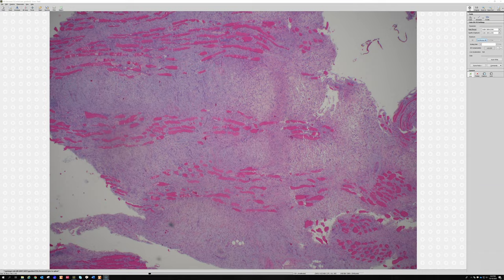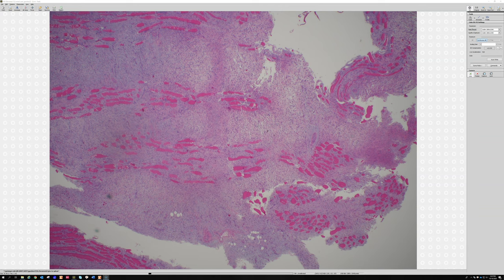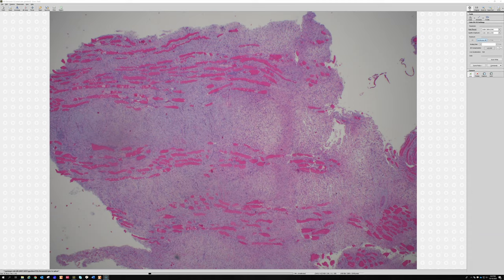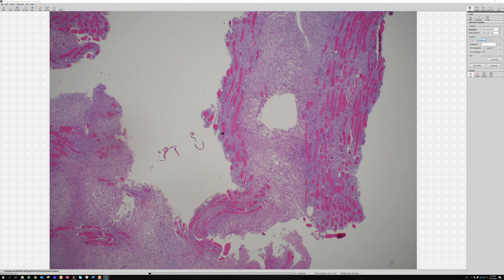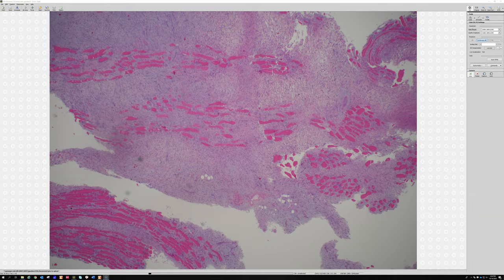Myxofibrosarcoma might infiltrate focally, but the fact that every single muscle fiber here is splayed apart perfectly is very characteristic of proliferative myositis. This case was actually one of the flat muscles of the forearm in an older patient, and the whole muscle was completely replaced on imaging — a characteristic feature in flat thin muscles. The radiologists already suspected myositis because the whole muscle gets replaced. Also helpful: there is no central mass here. The whole lesion is a patchy, checkerboard-like arrangement of splayed muscle and fasciitis tissue.